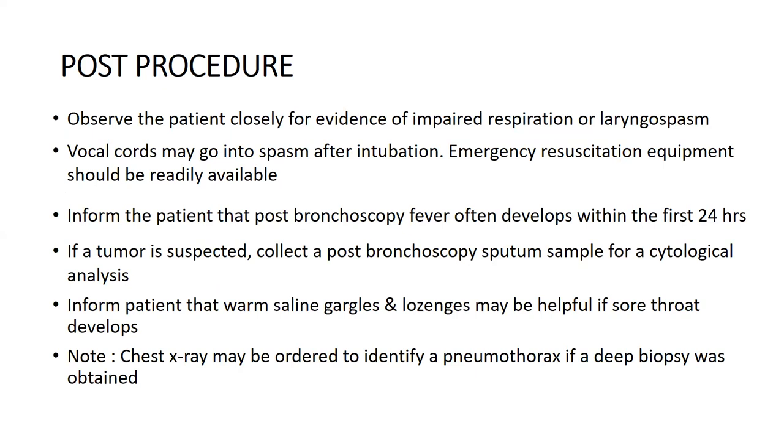The patient should be closely observed for any evidence of impaired respiration or laryngospasm. After intubation, the vocal cords may go into spasm, so emergency resuscitation equipment should be readily available. Inform the patient that post-bronchoscopy fever often develops within the first 24 hours. If a tumor is suspected, collect a post-bronchoscopic sputum sample for cytological analysis. Warm saline gargles and lozenges may be helpful if the patient develops a sore throat. A chest X-ray may be ordered to identify any pneumothorax after a deep biopsy.